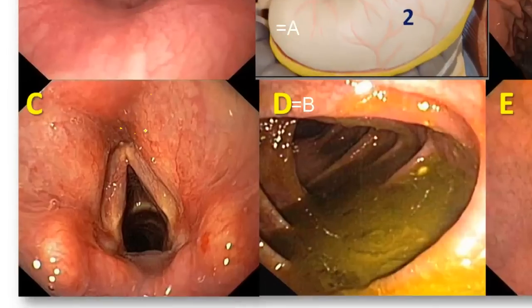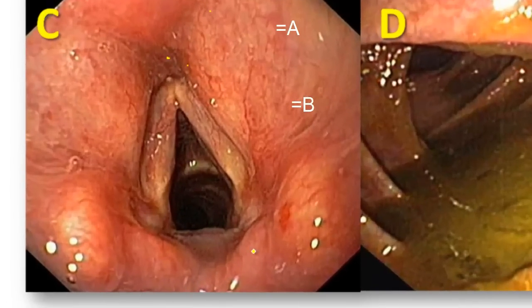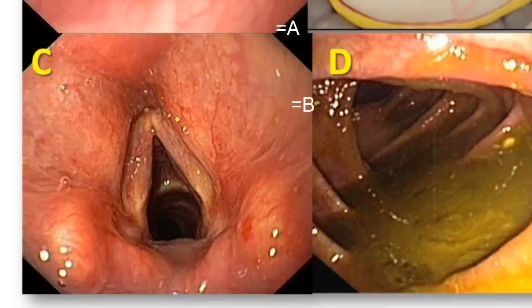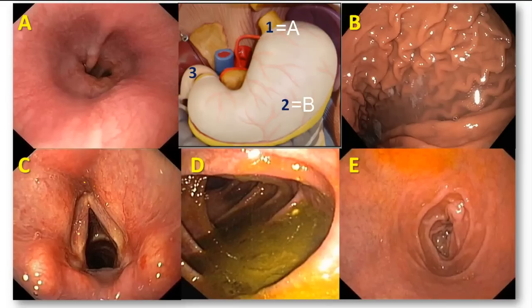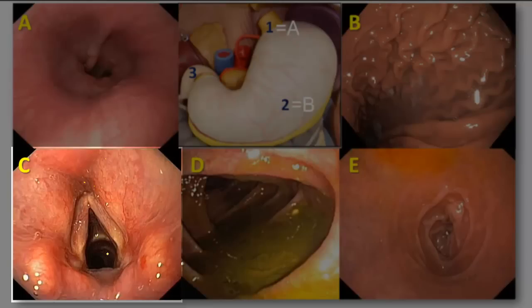Now let's look at C. This is a view of the inside of the larynx. These are the vocal folds. You can see through the opening between the vocal cords — the rima glottidis — you can see the trachea. So in fact, this is not an endoscope; it is a bronchoscope, and this shows the upper part of the larynx above the vocal folds. These are the arytenoid cartilages, and this is the root of the epiglottis. So it doesn't match with the first part of the duodenum.